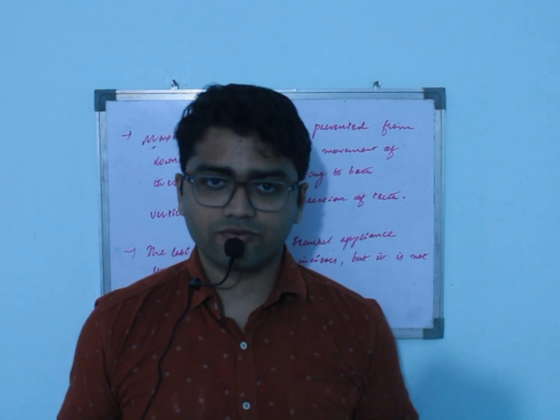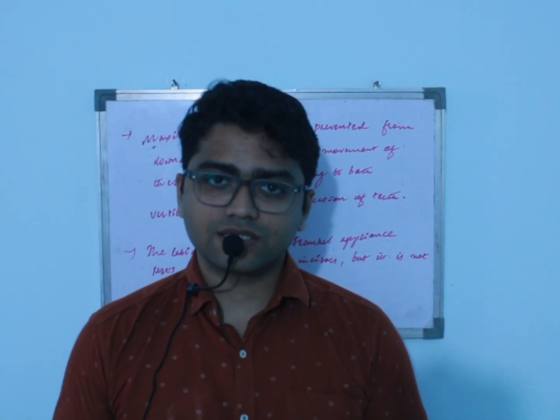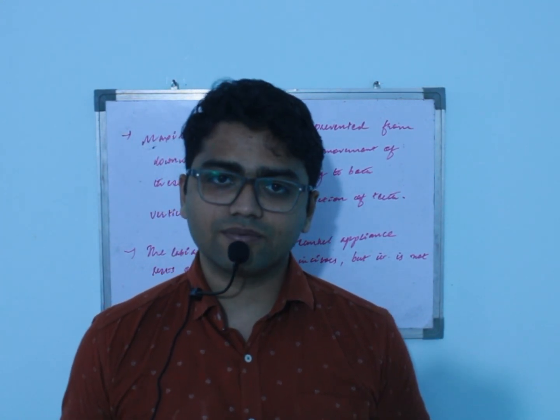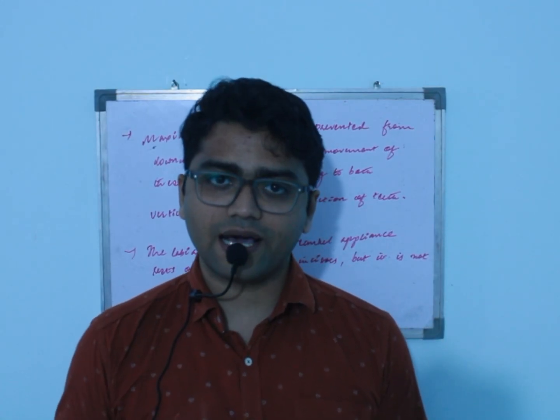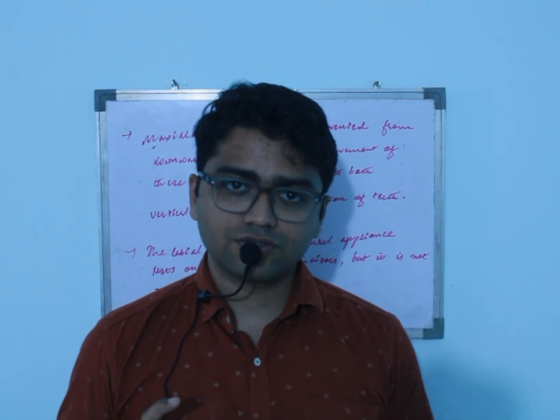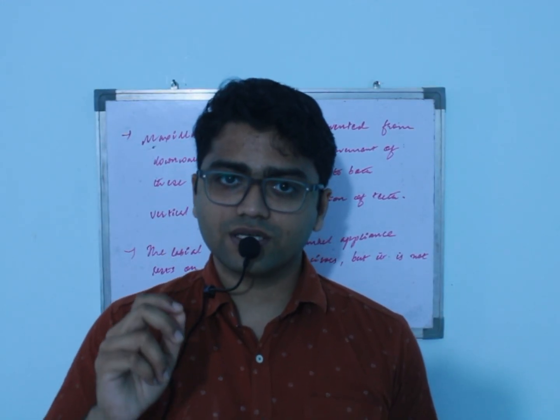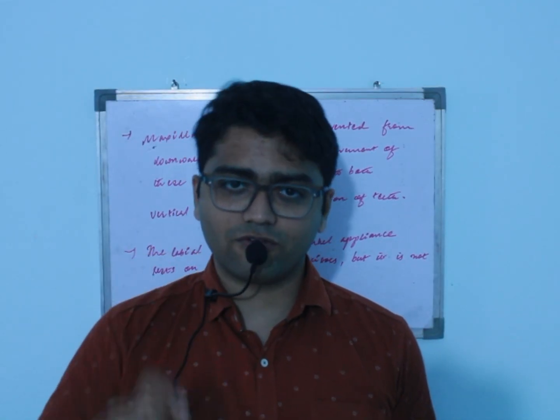Coming to the next part, we are speaking now about the maxillary molars. We do not require excessive eruption of the maxillary molars, so we give a maxillary molar rest in these areas. By giving the maxillary molar rest, we control the eruption of the maxillary molars in the vertical direction as well as the sagittal correction. So by giving the molar rest, I am not only engaging them into an orientation where they do not erupt to the occlusal part, but they also do not go sagittally forward.